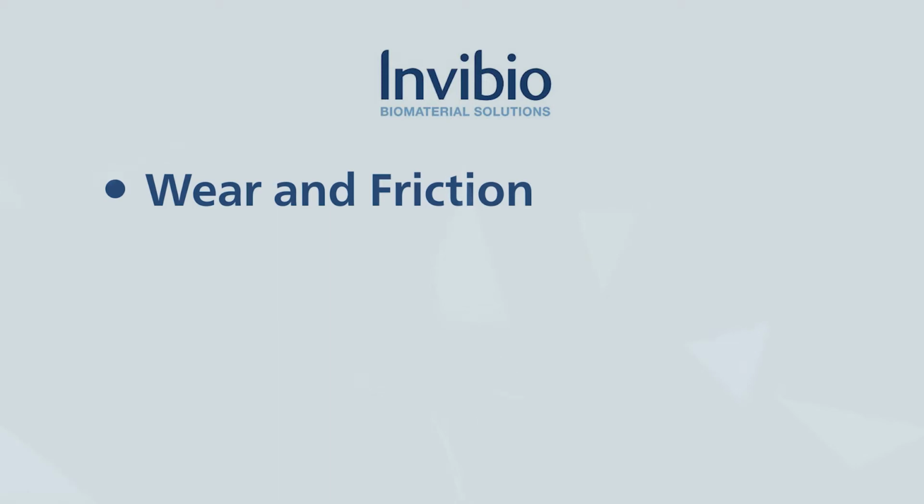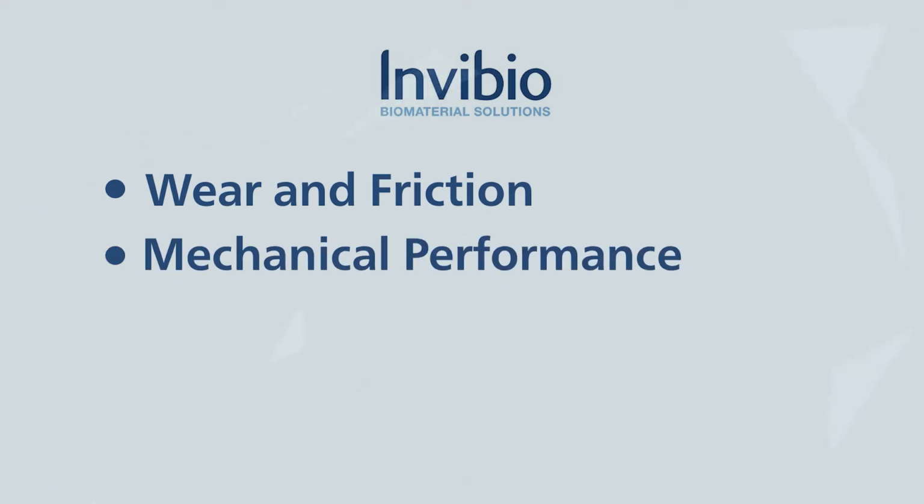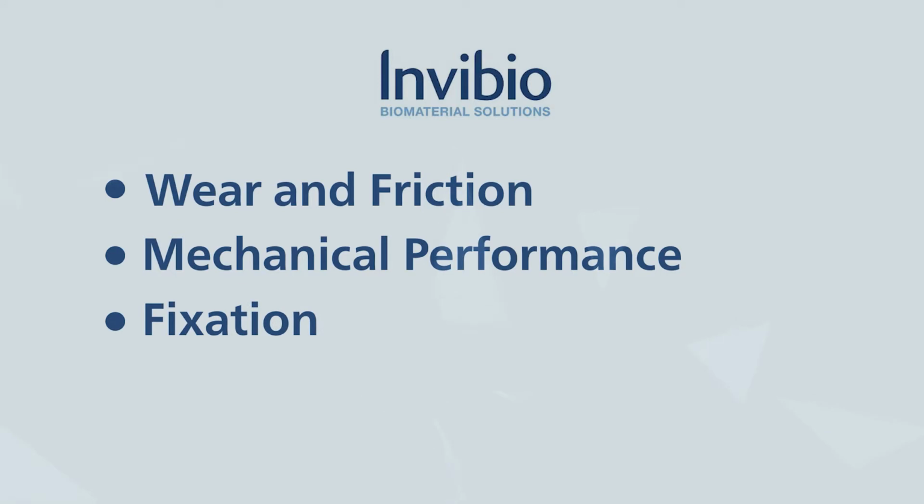A lot of the research around the total knee replacement has been looking into 4 different main areas. One area has been tribological aspects, so wear and friction. Another area has been the mechanical performance of the components, whether it's likely to deform or to break within the body. Another area has been looking at the fixation, and then a final aspect has been how it can be imaged within the body.